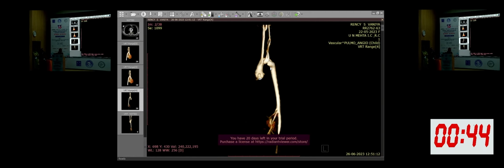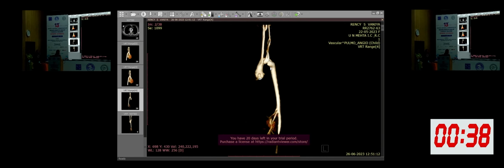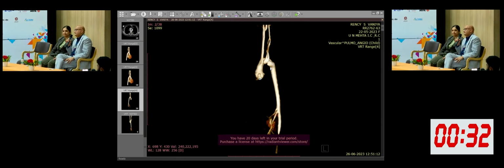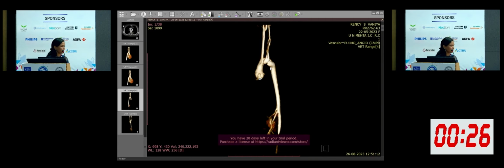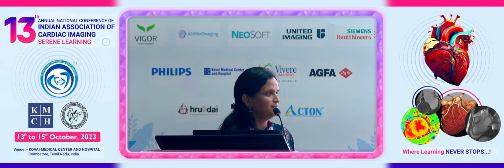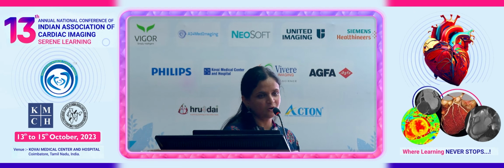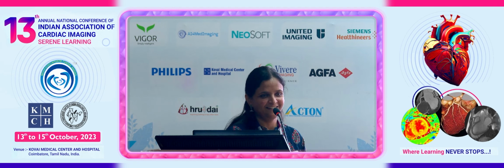Very simple. I think very, very interesting, very rare congenital case. My very basic elementary question is how do you do a CT scan on a child of that age? We sedate, since we are at an institute, so we have anesthetists available. We do 2 non-gated scans, both under GA, a quick run. In the second run we make sure to include the upper abdomen, because we have been able to diagnose a lot in that also.